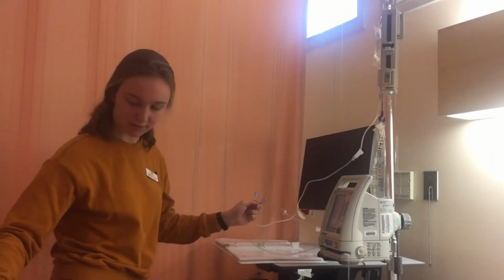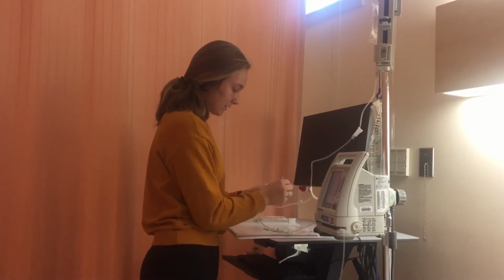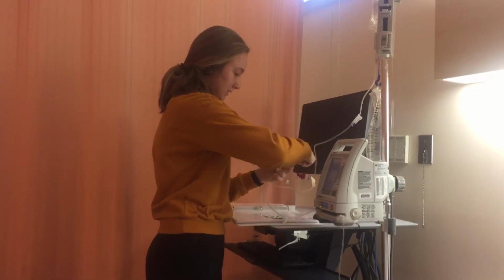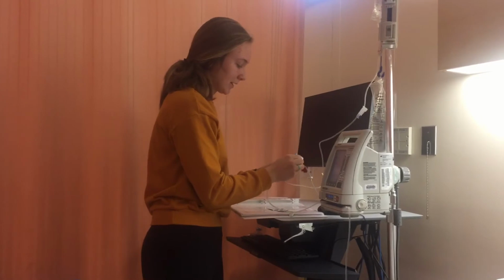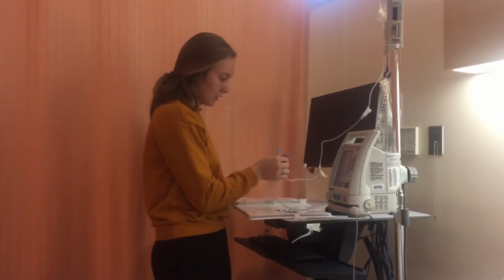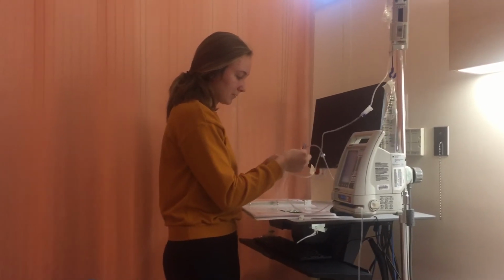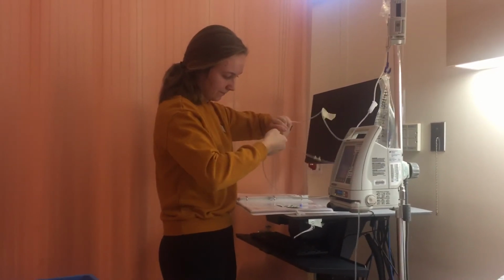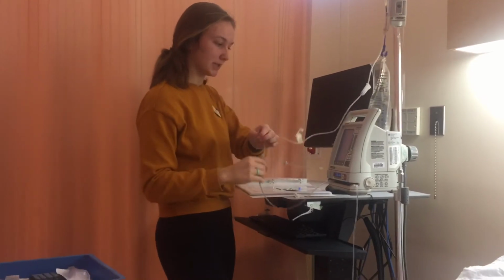So now I'm going to get an alcohol swab, and I'm going to swab this port for 30 seconds and dry for 15 because we want to make sure that there's no bacteria getting into the line. So I'm going to swab the port for 30 seconds, dry for 15. Good, and now I'm going to keep it sterile. And I'm going to remove this, and now I'm going to attach it. And the line is now attached.